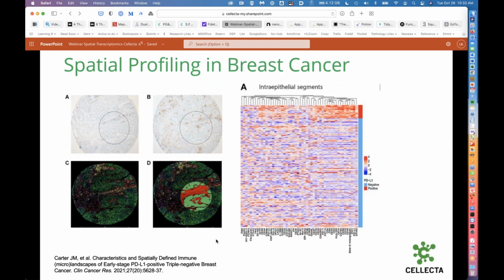The method has been applied to breast cancer and immuno-oncology. There was some specific interest in that in the poll. In this study, investigators looked at an aggressive triple-negative breast cancer and found that a subset of them, not a lot, a few, had detectable PD-L1, a marker of an immune response regulatory phenomenon in cancers, identified by immunohistochemistry, as shown as the little brown spots on this image here.